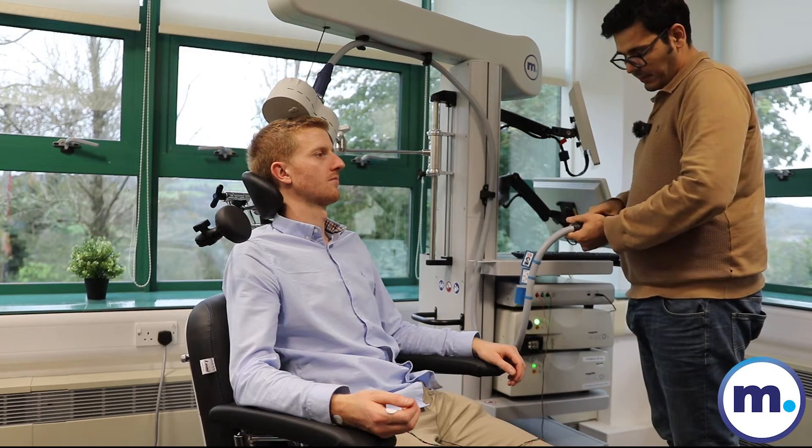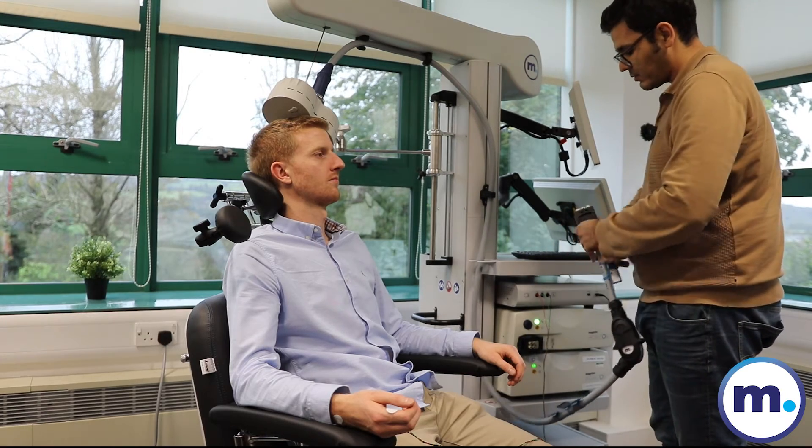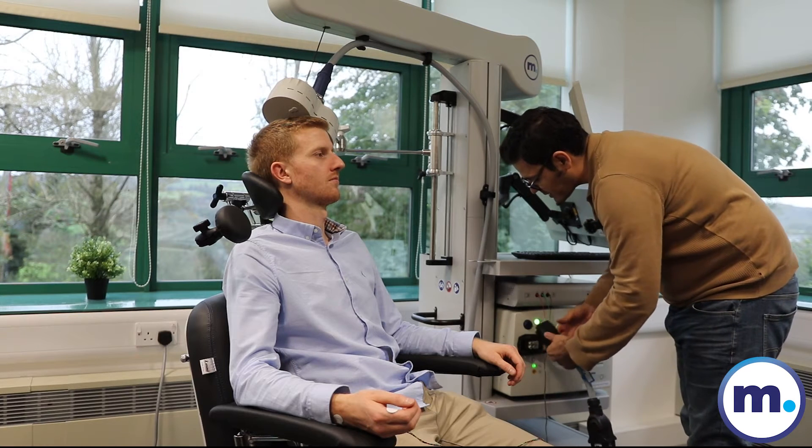The connection of the adapter is very easy. You just need to connect on one side then connect the device. No need to turn on the device, no need to make any adjustment in the device.